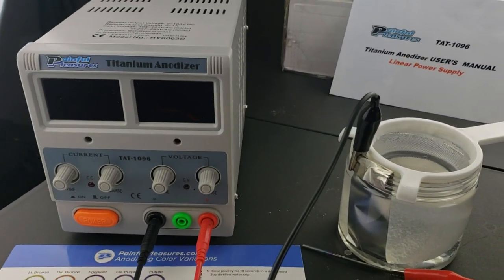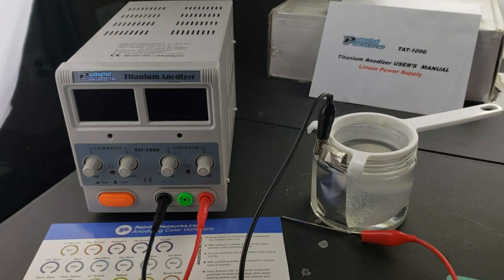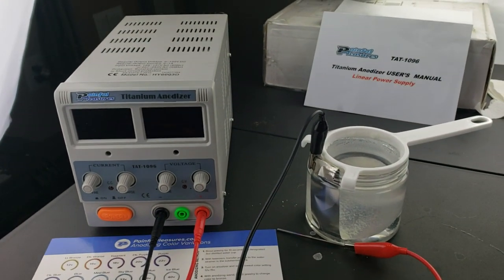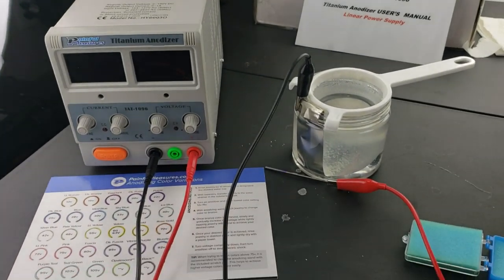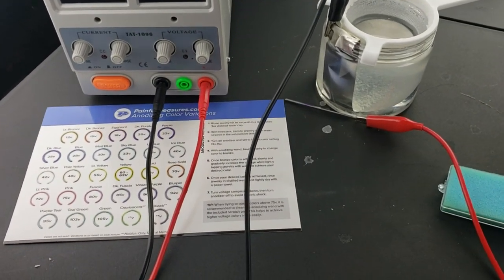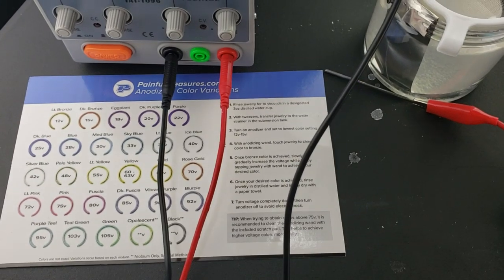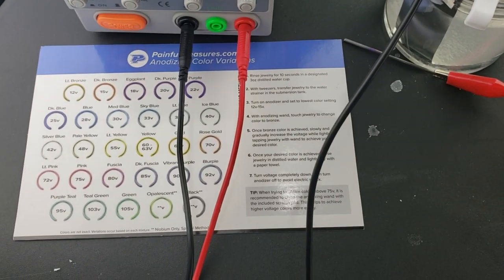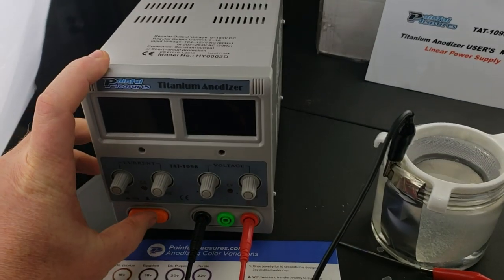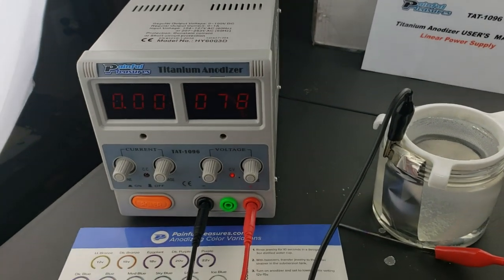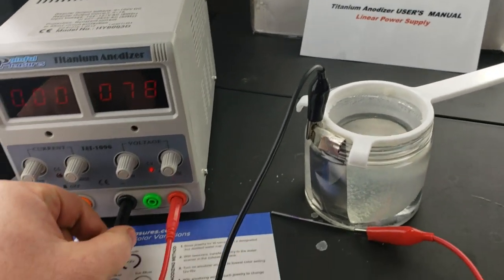This is what the anodizer looks like. The version I purchased, and there's many of them out there, is from Painful Pleasures, which is a piercing supply place. Definitely make sure your significant other knows what that is on the credit card bill. It's a very simple piece of equipment with just a power switch.